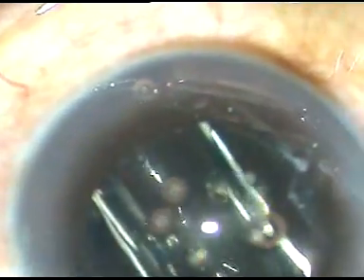In this case I have implanted a hydrophobic acrylic intraocular lens. A viscoelastic substance — HPMC in this case — has been used for implantation and now has to be thoroughly removed. I remove it in several steps. First I use a Simcoe cannula — this is stage 1. There is about 6 cc of BSS in a syringe.